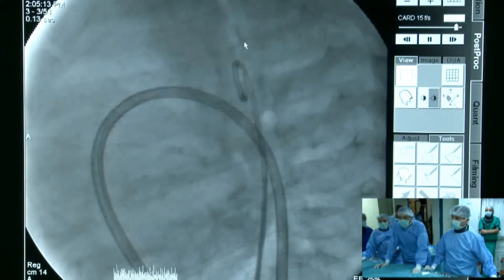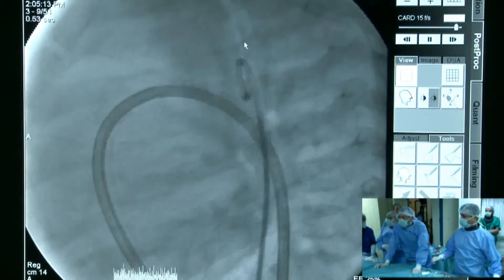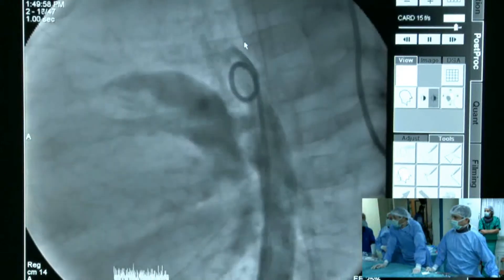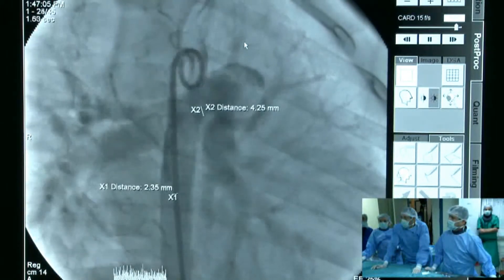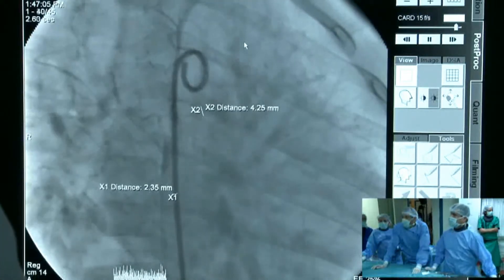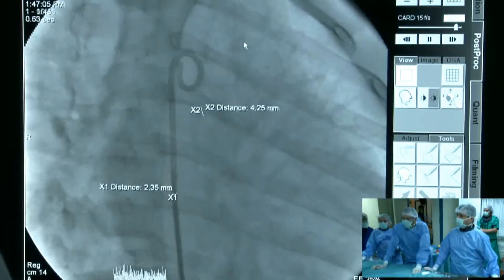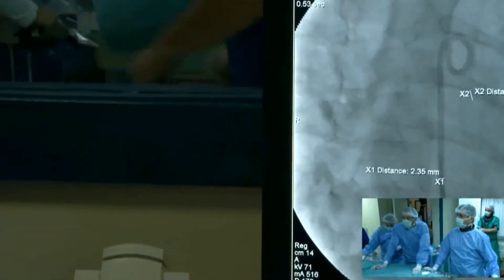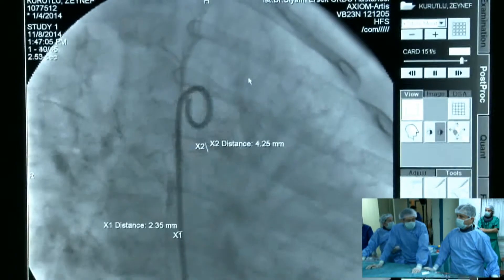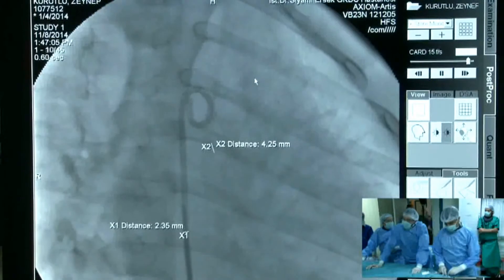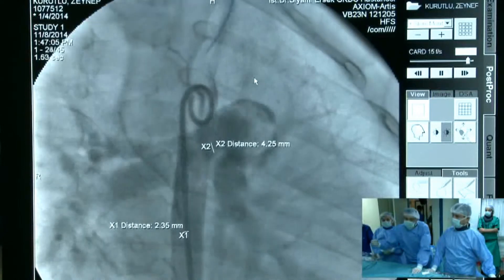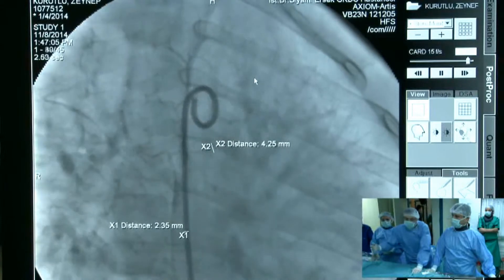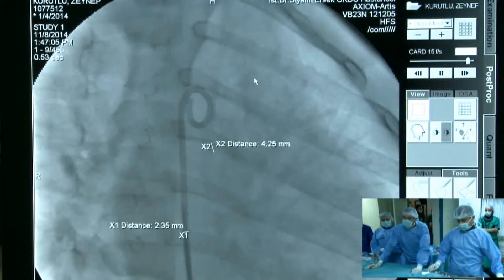Would you show us the RAO projection again? That is probably much better to visualize the silhouette of the ductus. Do you have the angiogram with the sheath in? No, because it is monoplane. Omar is right — if we use ADO1, we must measure ascending and descending aortic pressures before device release to prevent coarctation, and we need RAO and lateral projections to confirm correct embedding.